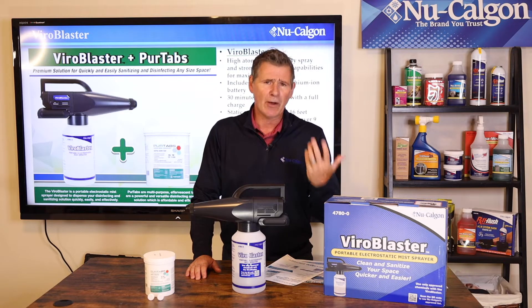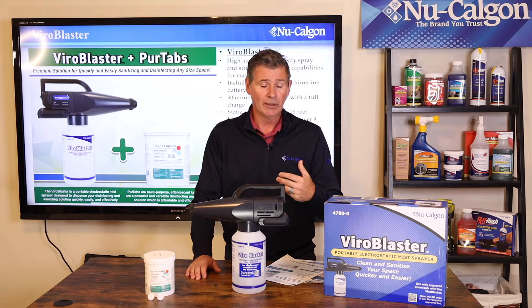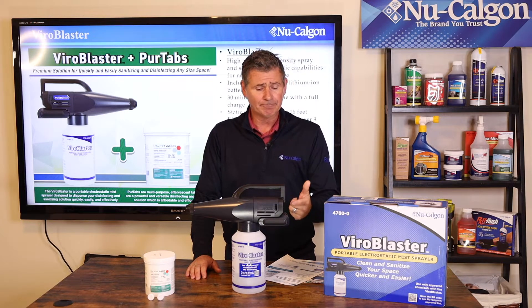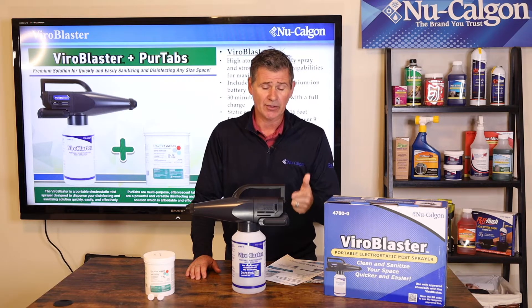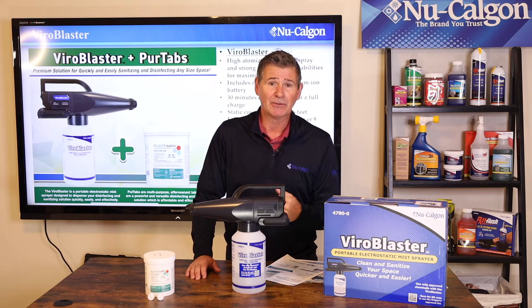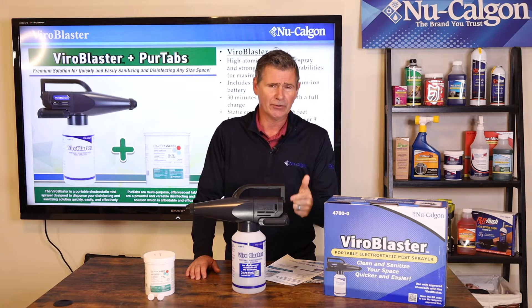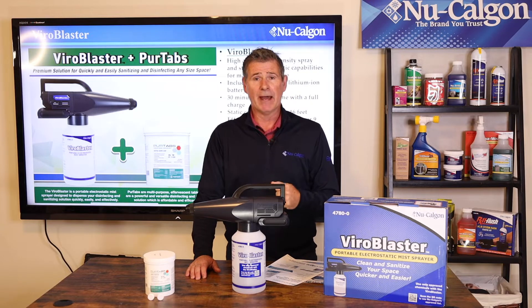We do offer extra batteries for sale as well as extra chargers. If you have a customer at a large healthcare facility like a hospital, nursing home, or university, they're going to want to have extra batteries and extra chargers, because you don't want to get halfway across campus disinfecting the cafeteria and run out of battery charge. This will give you about 30 minutes of continuous runtime off that battery.